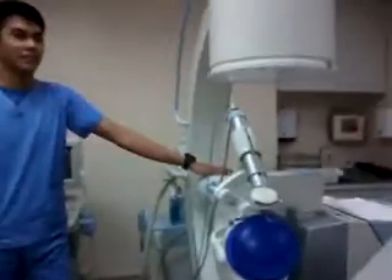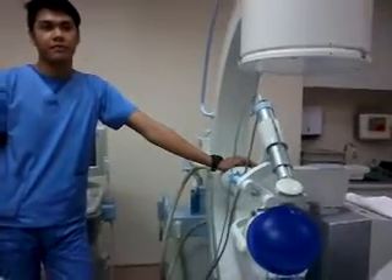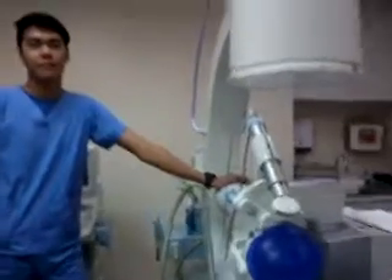So that's what the patient experiences. For the kidney procedure, they receive 3,000 shots — that was just one. The patients are sedated so that we can complete the procedure comfortably.